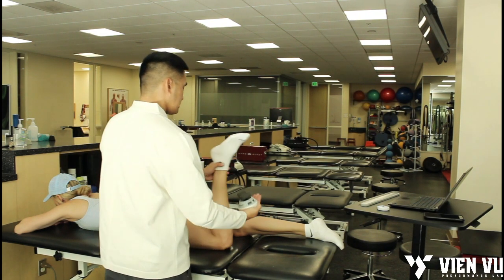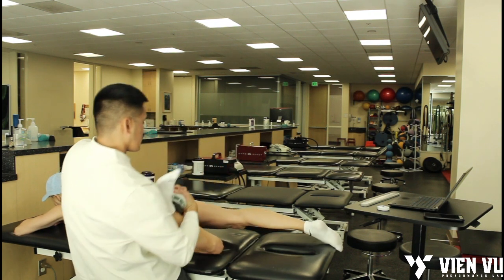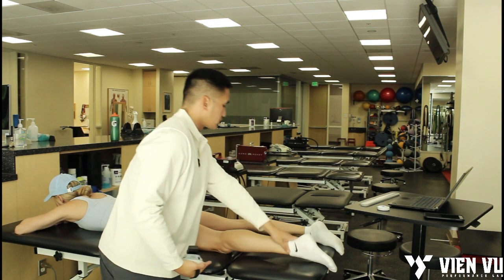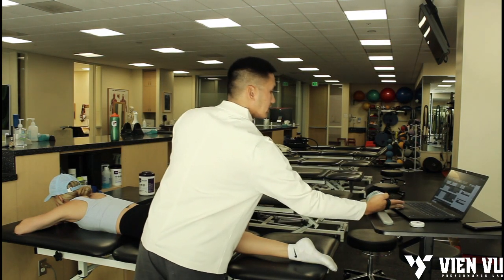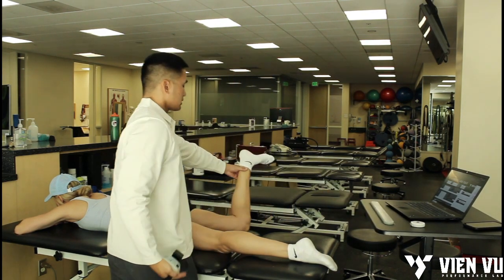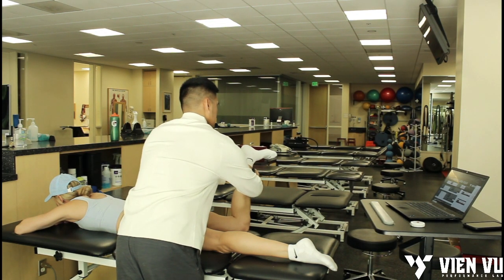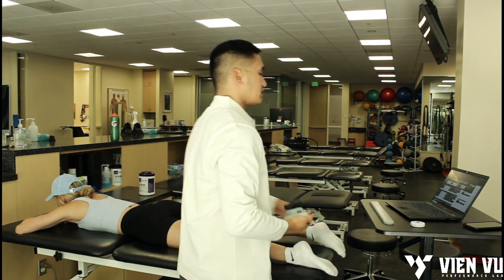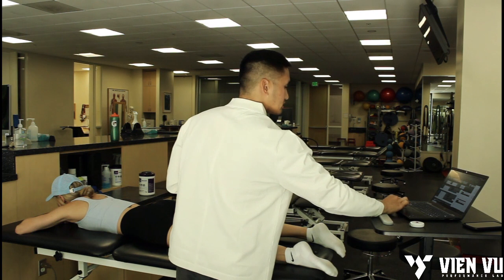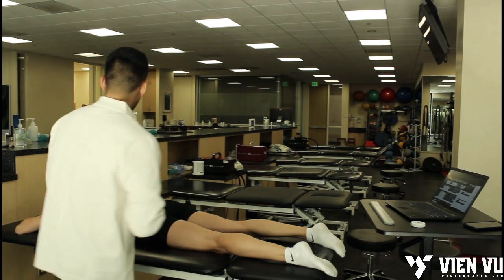Now I'm going to move my positioning and test external rotation of the left side — the uninvolved side. Start here, ready and go — push, push, push, good. Then we're going to go into internal rotation — push, push, push, good. That's involved internal rotation — I'll type that in.